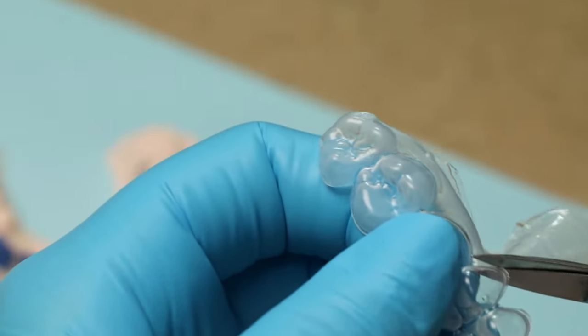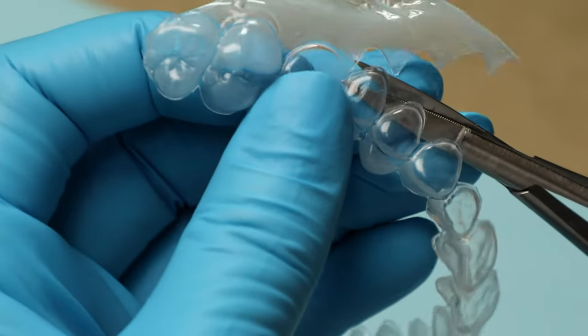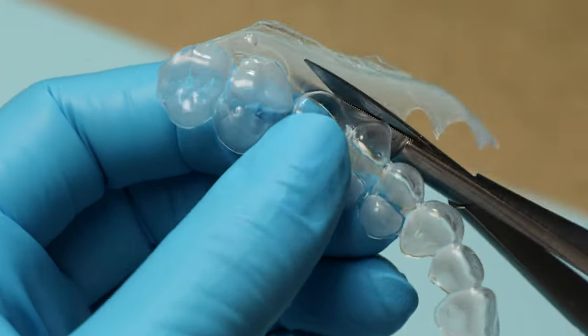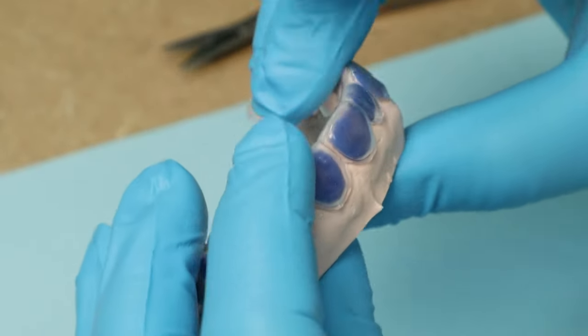Scallop edges to avoid contact with gingival tissue. Return tray to model and check tray extensions.